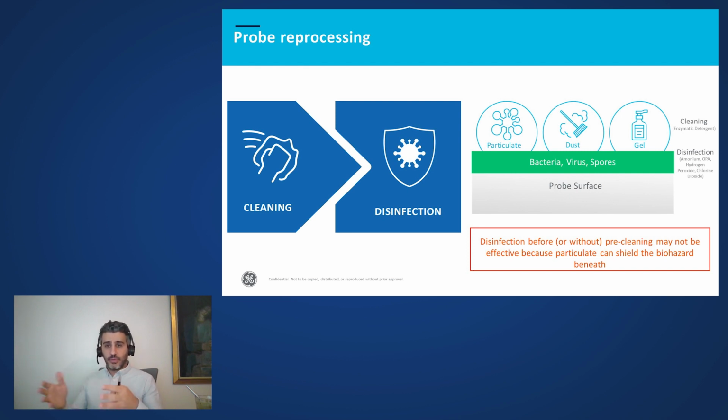If we don't do the cleaning in a proper way, there is a risk that disinfection will not be done in an effective way, because some particles may hide a biohazard beneath and therefore it is very hard for the disinfection chemicals to take it away.